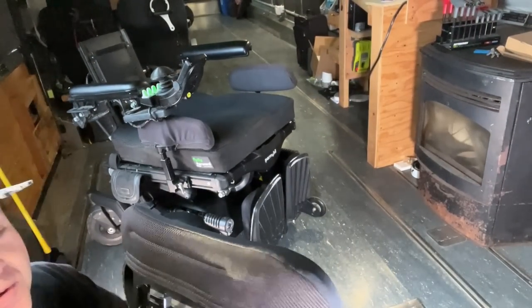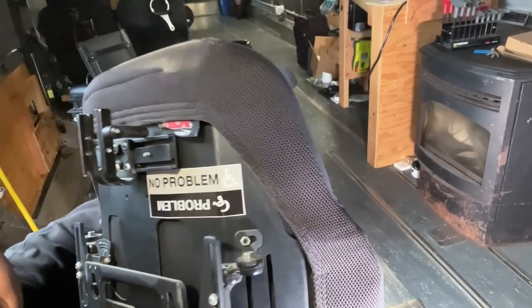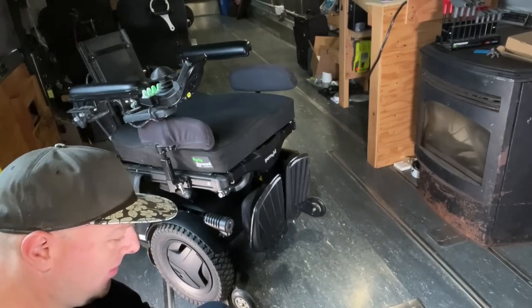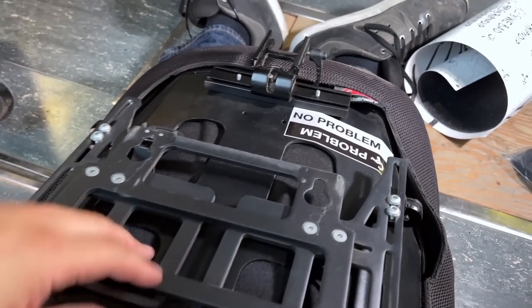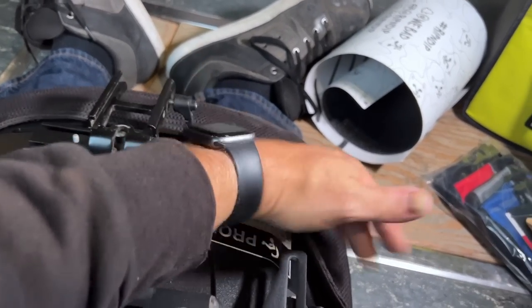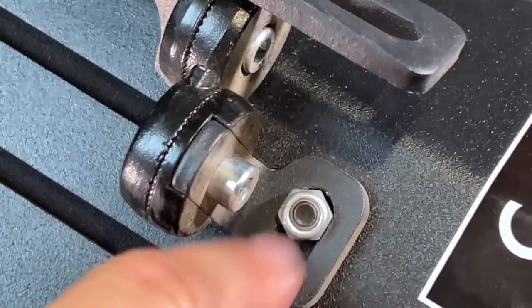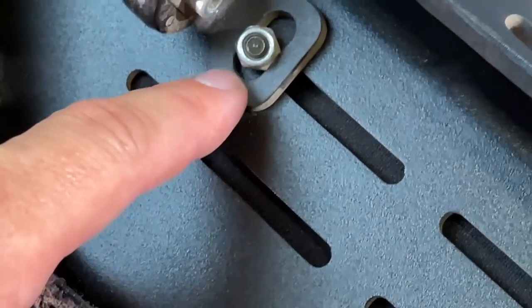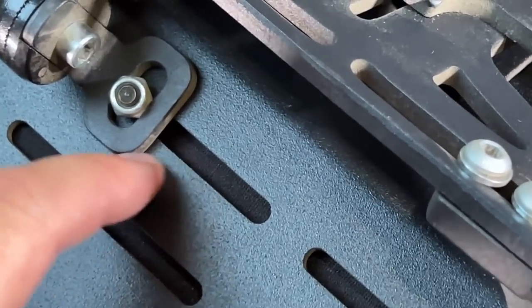Thank you to the person that sent me these little decals like four years ago — I just finally got them installed on my seat back. This floor is not very clean; I probably should have put something down. Here's our direct backrest adapter — I'm using Stealth Products ADI deep curve backrest. Here's the problem: if you look close at this nut, it is not the right size. And all of them — see how there's no washers? They're just kind of digging down in here. There should be washers. These are flat-cut holes, but on the inside they used machine screws with tapered heads, so those are gouging out the inside.